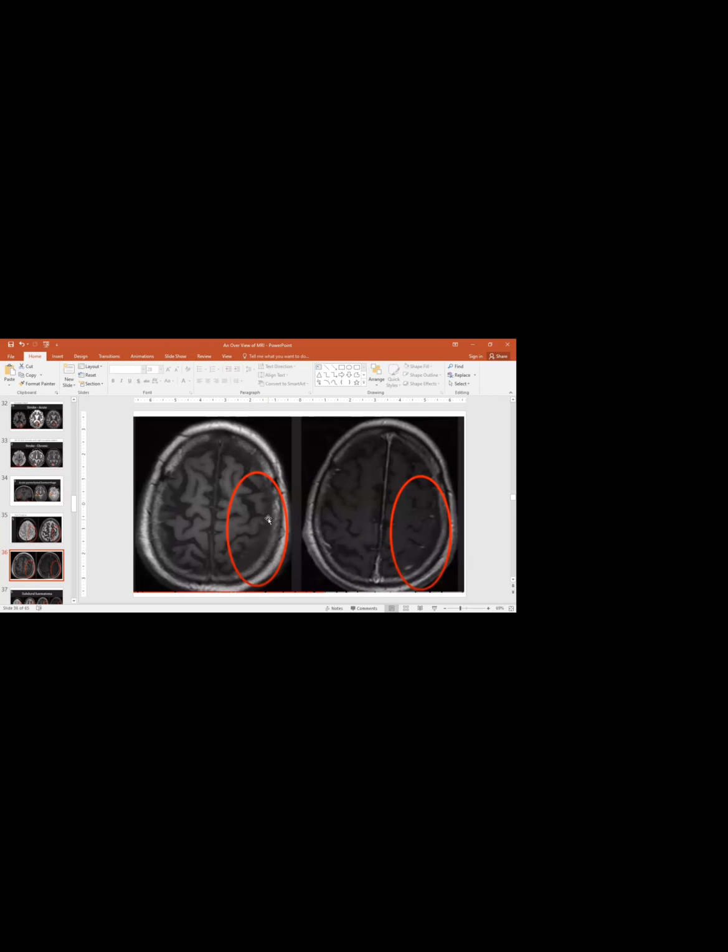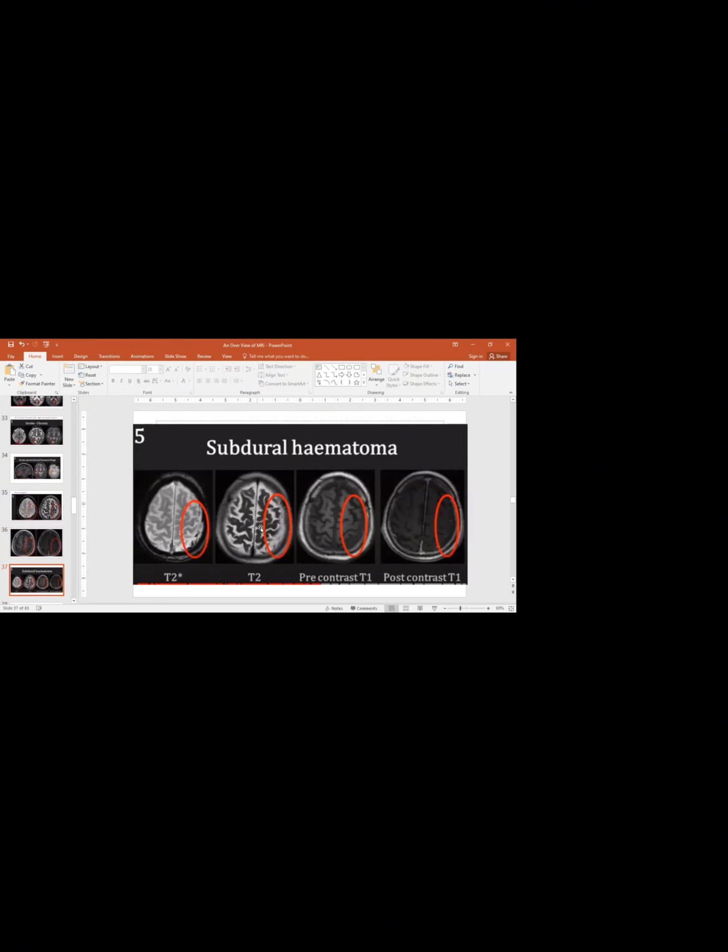Beneath the skull bone, you can see the sulci and gyri. They were not clearly visible. And there was a small homogeneous area covering those sulci and gyri. We came to the idea that this person, due to this surgery, got this subdural hematoma.